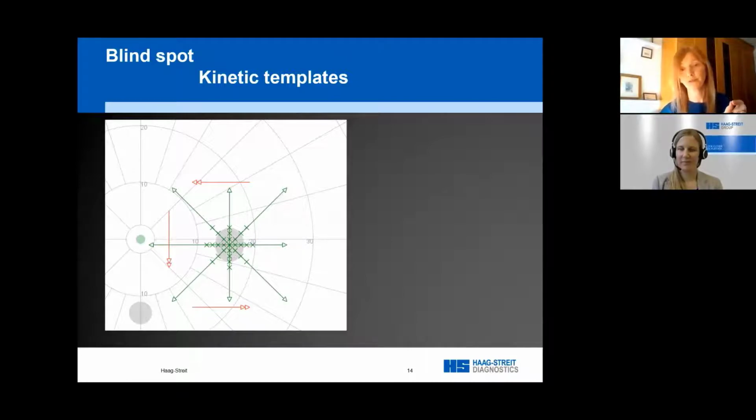So the computer will document or record the time from onset of the stimulus to when the patient responds. And that's the latency period from when the patient saw it to reacting to it. You can then adjust for that reaction time variance with the patient. It allows then, if the reaction time is very long, for the blind spot to be increased or decreased in size.